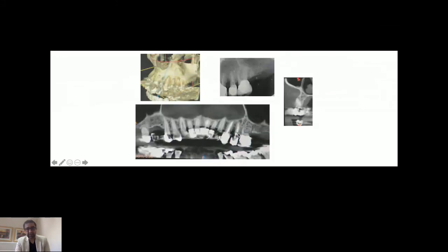We're going to take the 5 out. You can see 5 is gone. It's got a periapical radiolucency as well. But with the help of CBCT, we were aware that we will be able to place implant immediately. There will be enough bone around it to place the implant immediately. Not loaded, by the way, only place it.